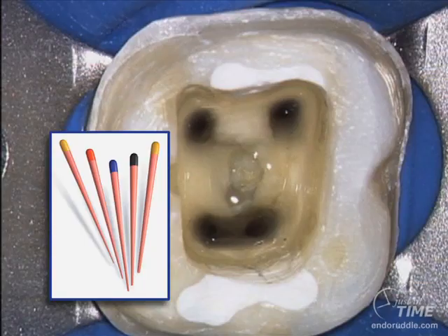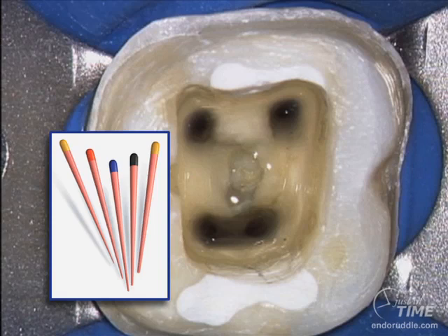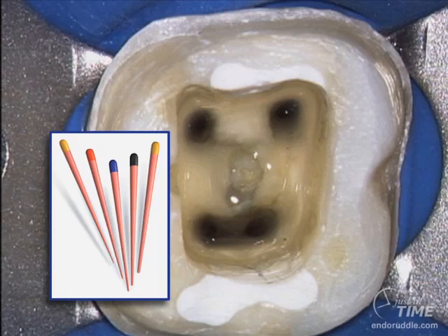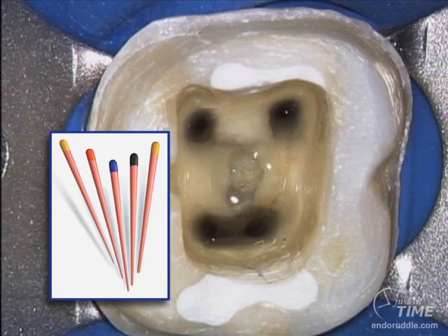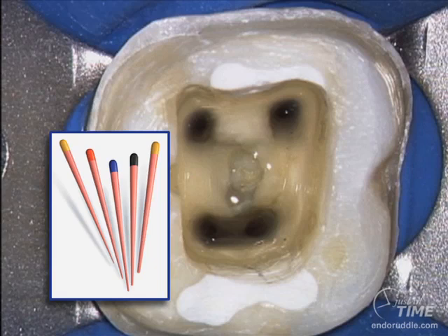When we look into the access cavities of teeth that have been shaped and disinfected, we choose gutta percha cones — in the vertical condensation technique we start with a cone fit. For ProTaper shapes, ProTaper has its own matching gutta percha cones to match the specific finishing files. We always fit cones in a wet canal because that more closely simulates the ensuing step when we dry the canals and lubricate the cone with a cement or sealer, which helps the cone slide through the pathway to the terminus. Always fit cones in a wet canal versus a dry canal so you don't have artificial tugback.